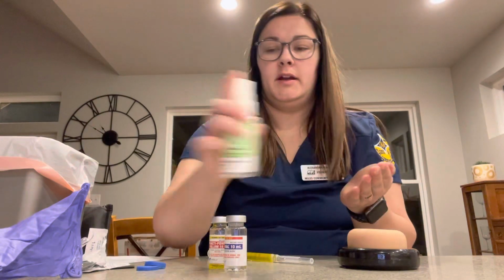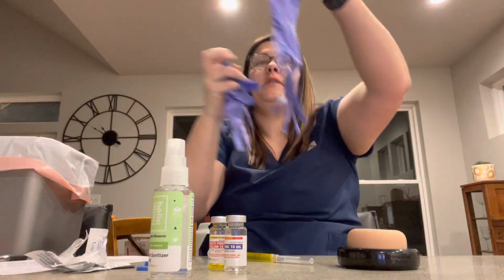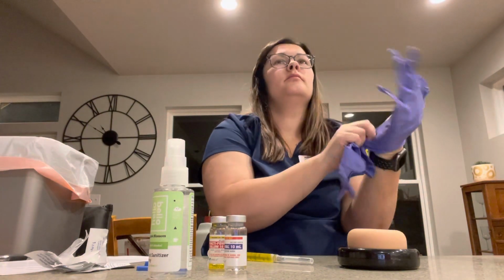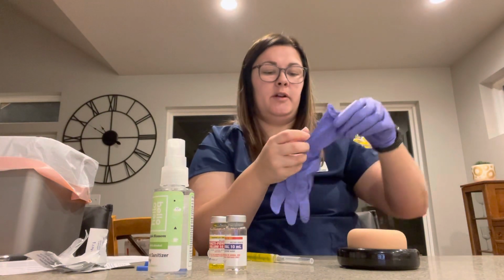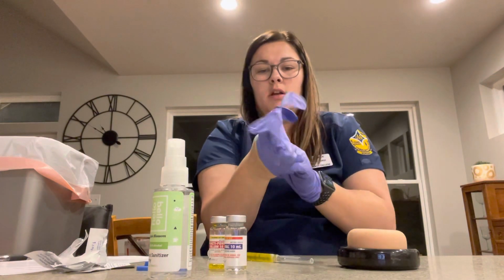I will perform hand hygiene and put on gloves while also identifying my patient using 2 forms of identification. Can I please get your name and date of birth? Skip Rocker, 1/1/1972. Hi, Skip. Do you have any allergies I should be aware of? Celebrex. Okay, I do have that in my chart here.